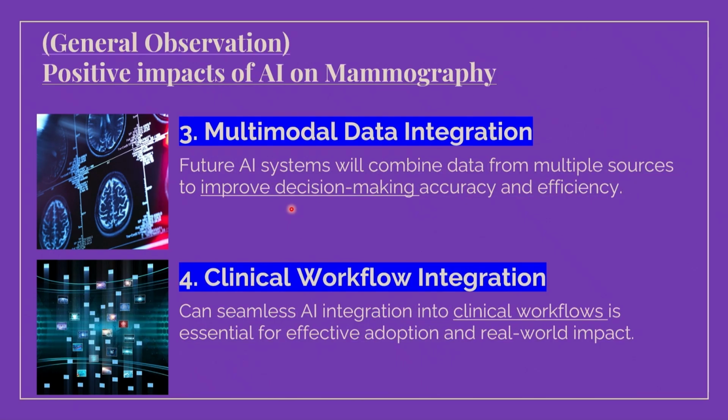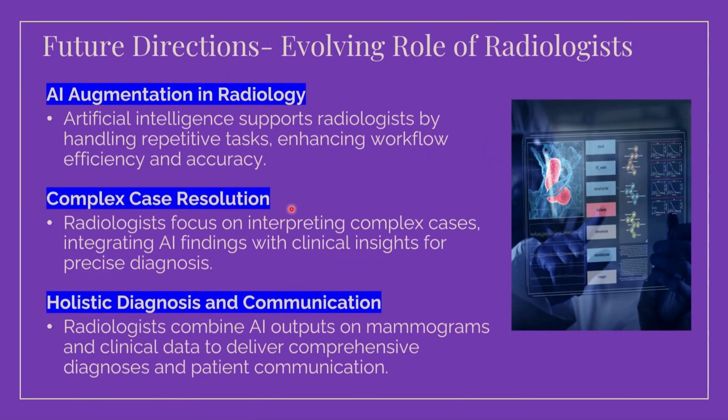In the future, we can combine more than one modality for the radiologists to make a better prediction, and we also hope that AI can help radiographers doing mammography screening, with very fast decisions using the AI support, so that we can make an on-time decision on whether the patients should be recalled immediately after the screening mammography process.